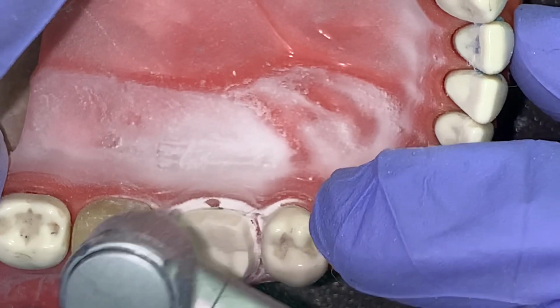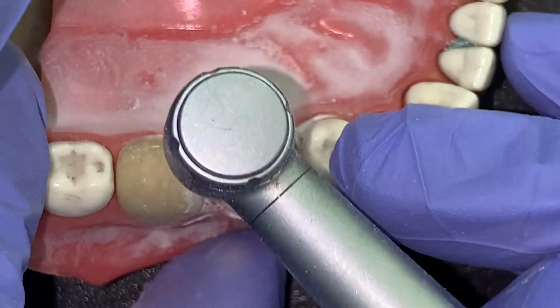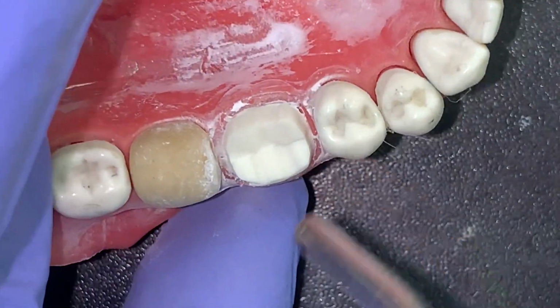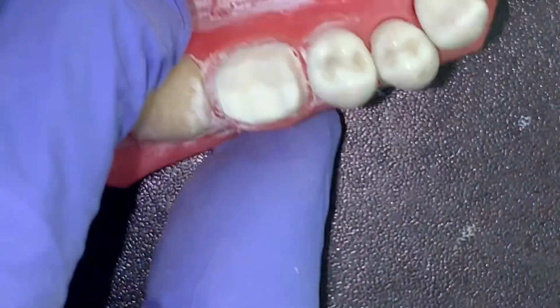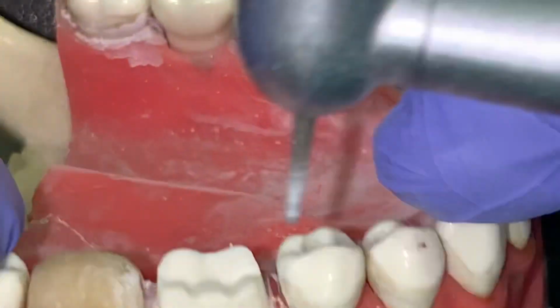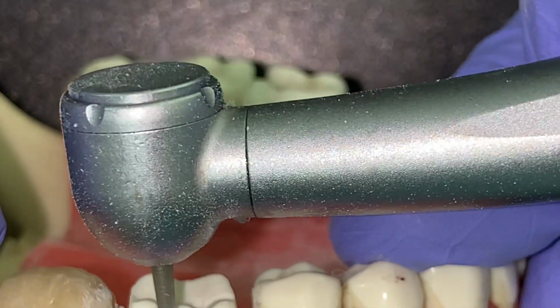Whenever we are doing a tooth preparation, or if we are preparing a tooth for any indirect restoration, you have to avoid any undercuts. And number two, there should be no sharp line angles in any part of the preparation. Everything is to be rounded.